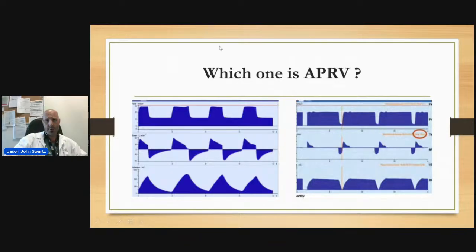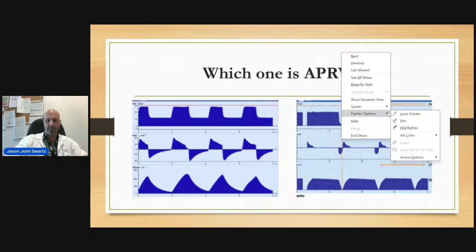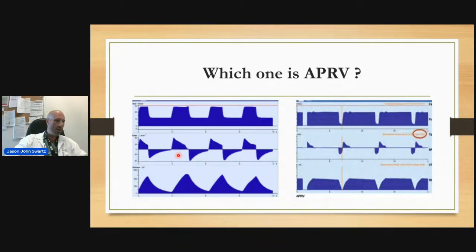So the way time-controlled adaptive ventilation, APRV, should be set up when it's used with that method should not look like this at all. There shouldn't be breathing on a P high level and then breathing on a P low level and then back up. What we should be doing is breathing spontaneously on this P high level, and these brief releases occur to help eliminate the CO2, or they are not breathing spontaneously and they are just passively being ventilated.